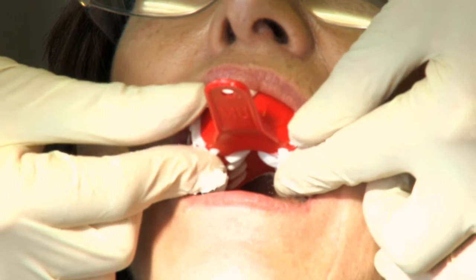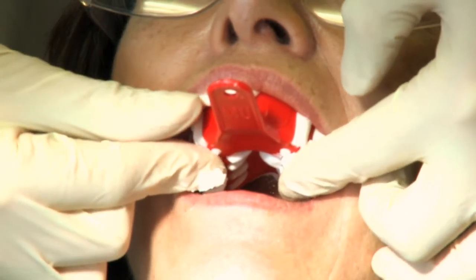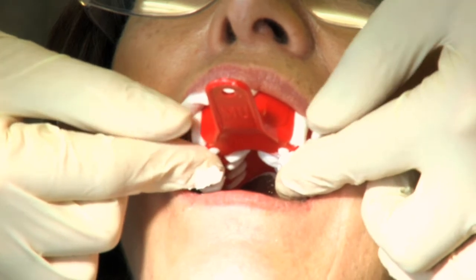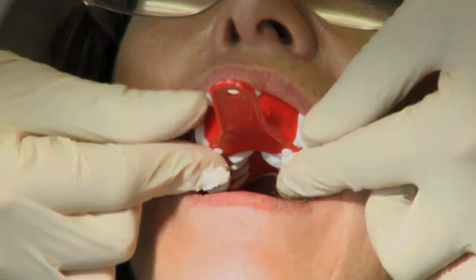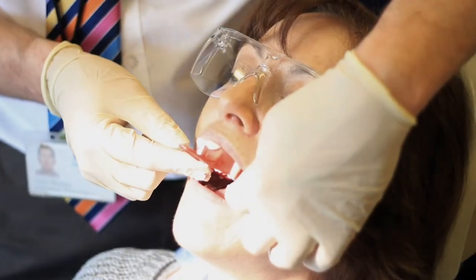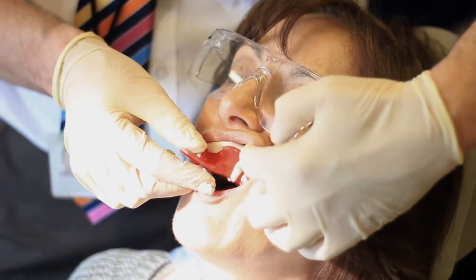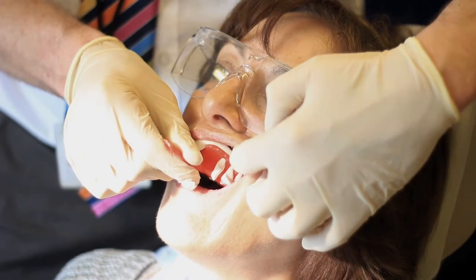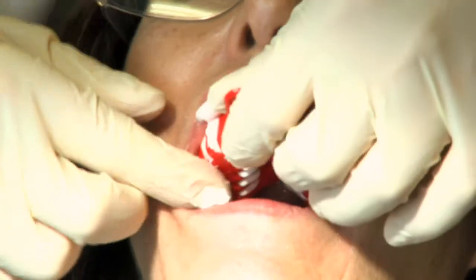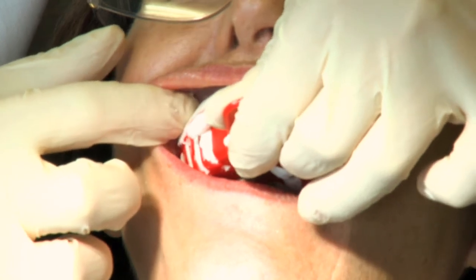And just check it's setting nicely. We hold the upper impression in place because gravity will make it drop down, and that can lead to all sorts of faults with the impression. Good, and what we'll do, we'll take the impression out now, so we'll just stretch the cheek out the way and just gently ease the impression out of the patient's mouth. Same on the other side, just gently ease the impression out of the patient's mouth.